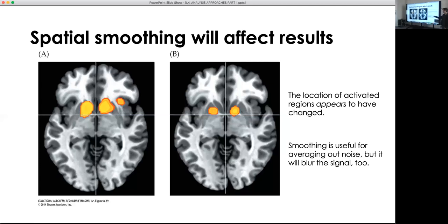So this hotspot, even though it's a yellow pixel placed right there, actually represents a footprint on the brain. You've smoothed nearby voxels into it. So yellow being here doesn't actually mean that location; it means the locations around it. If you just plot this figure, it's a little misleading unless you know what has been going on.